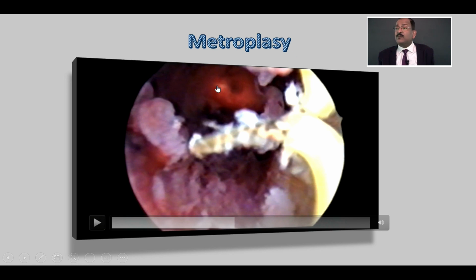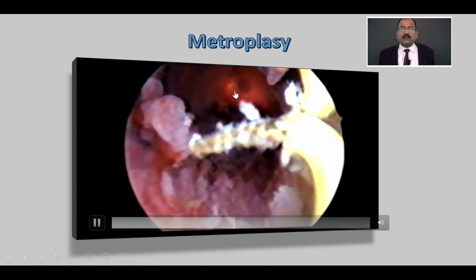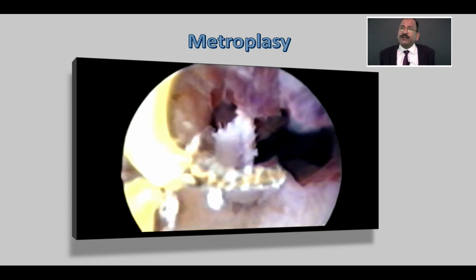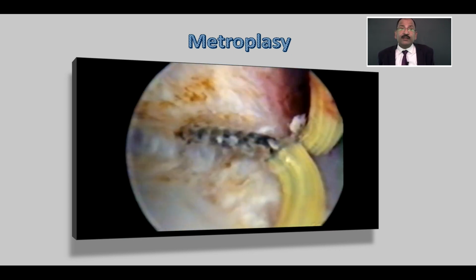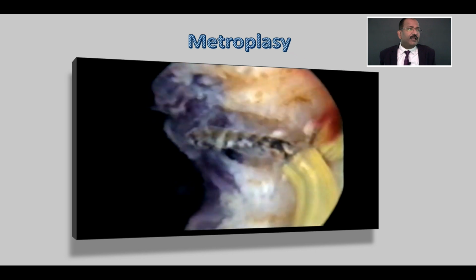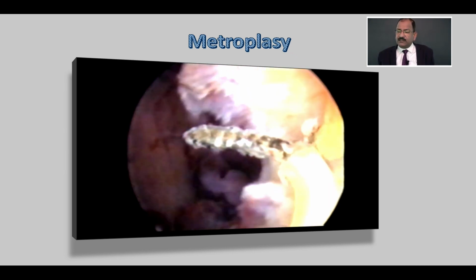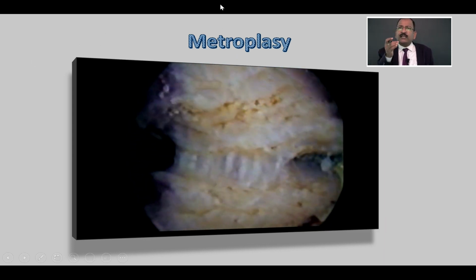Here, see this light. This light is laparoscope light. The laparoscope will be brought nearer, the hysteroscopic light you have to decrease. And this red color will give you your distance, because red color has a property of giving you maximum attraction. That's why red absorbs light very fast. Red penetrates your eye very fast. That's why red is used as a danger sign all over the world. For traffic, for railway, everywhere. So this will be transilluminating. Now we can see that the surrounding wall has started to be visible and it is too thick. So several steps you need to cut.